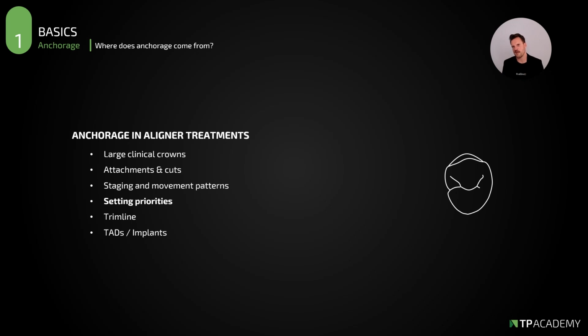Because we have a lot of AI, a lot of artificial intelligence. We have algorithms in the software, which is beautiful. But these software patterns are not made to set priorities. You are made to set the priorities. You know what is most important for your patient. So you are the one programming the software in the right way and setting the right priorities. Otherwise, the software always will do, let's say, everything at the same time, which could be very, very frustrating.